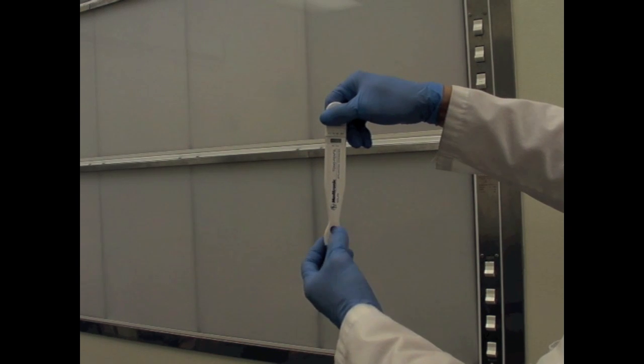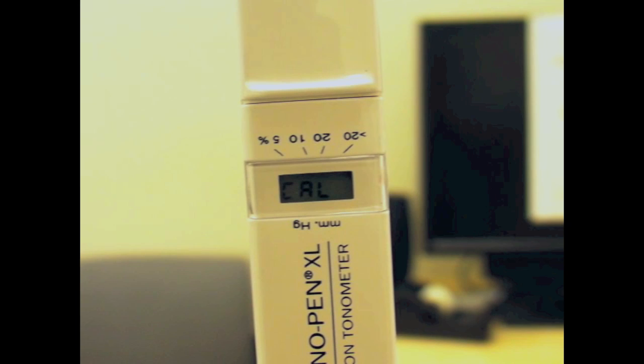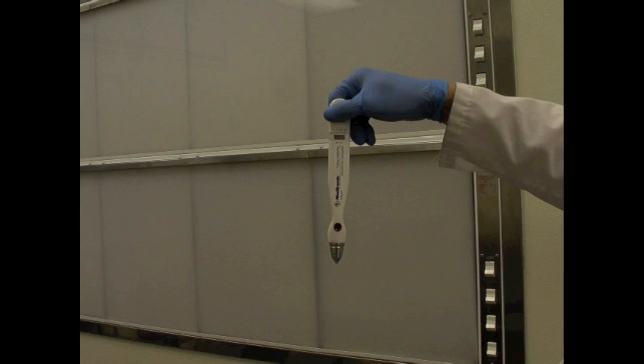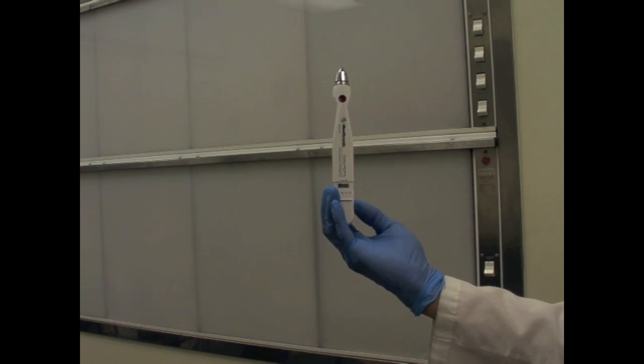Double click the Calibrate button. After hearing two successive beeps, you should see the letters C-A-L. After a slight delay, you will hear another beep accompanied by the text UP. Point the tip of the pen upwards to complete the calibration.